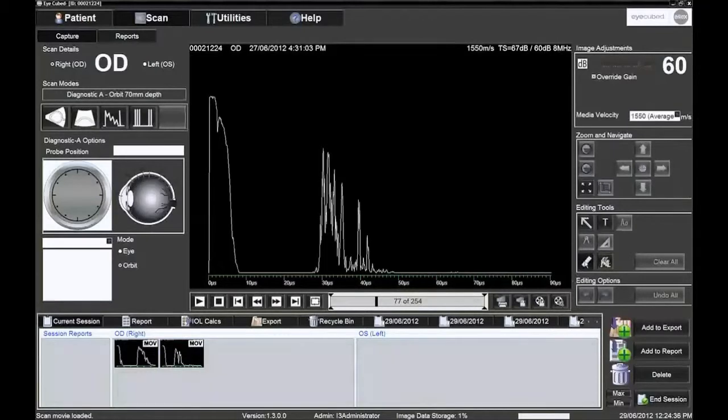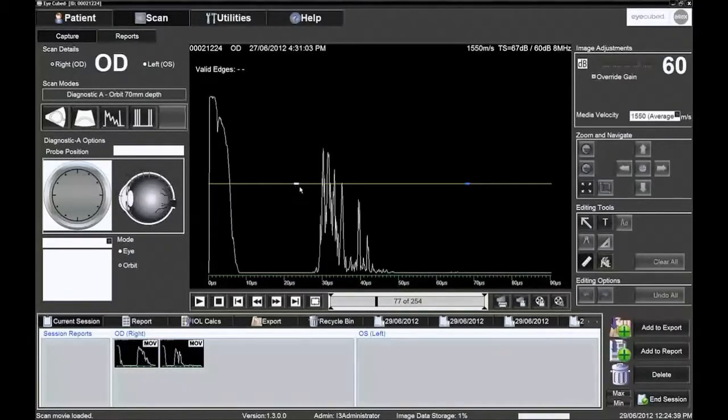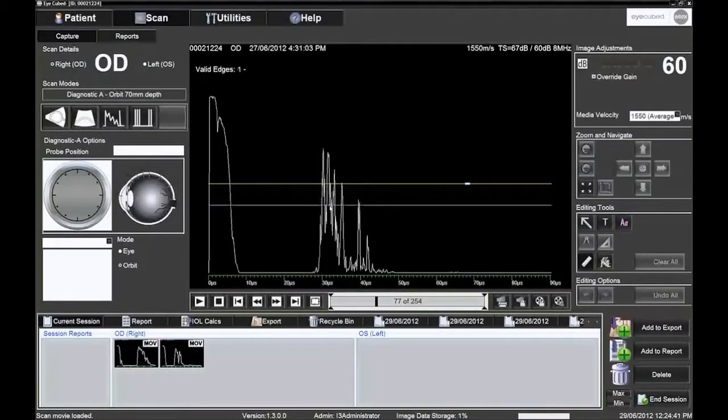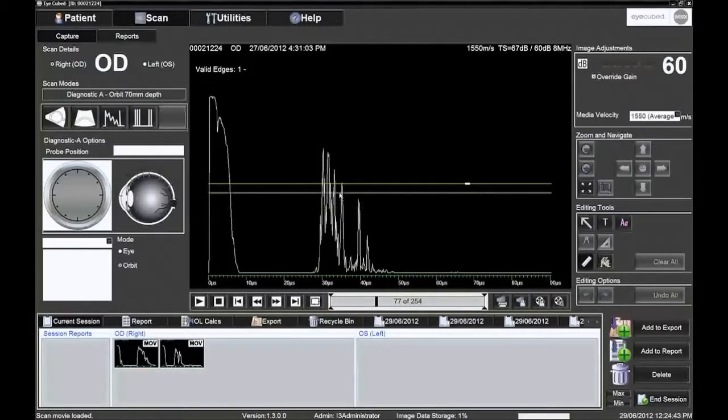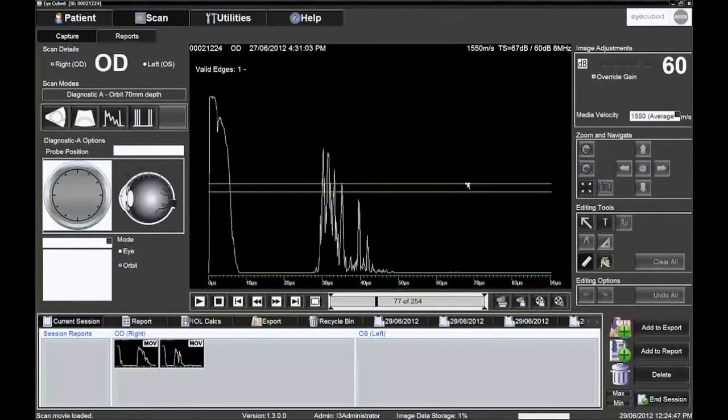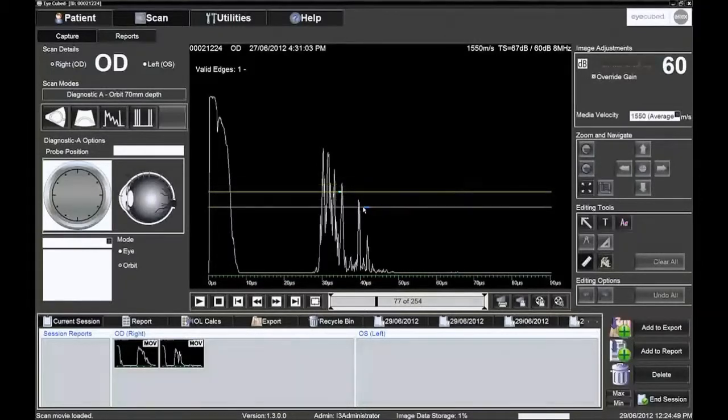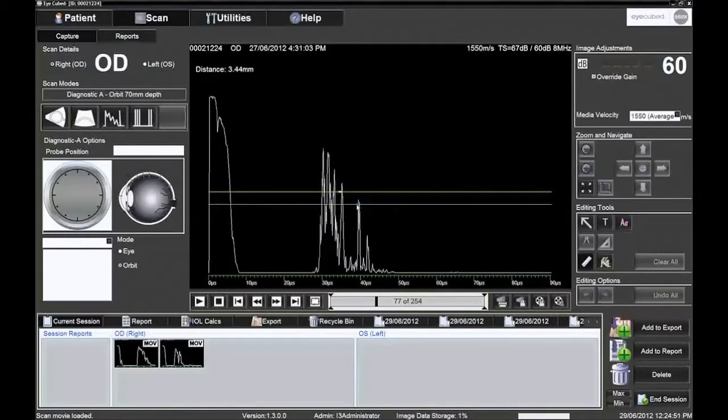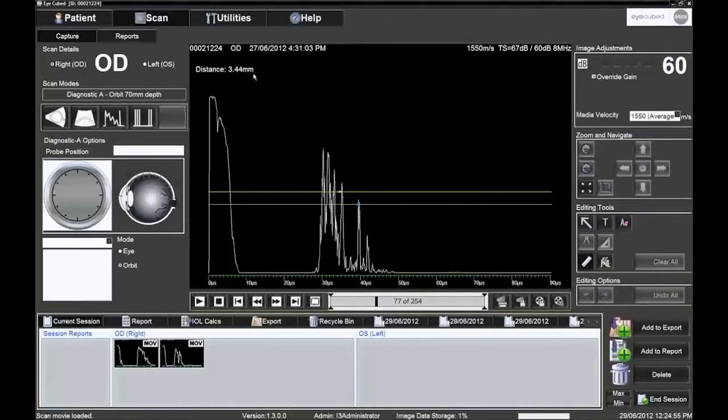The measurement scale is in microseconds of ultrasound time. It is possible to make a measurement in millimetres using the ruler in the editing tools and the chosen media velocity, which depends on the tissue to be measured. In this example, 1550 metres per second. The caliper is on the lower left side under editing tools.